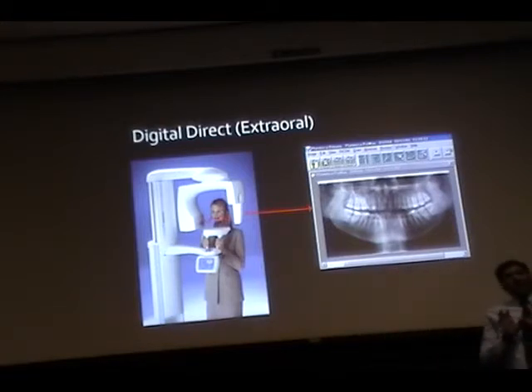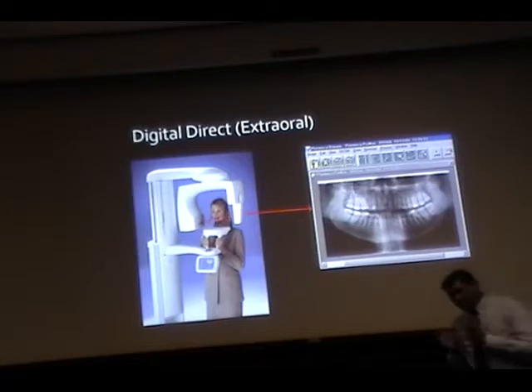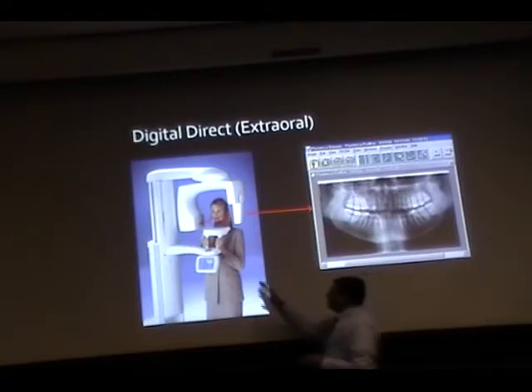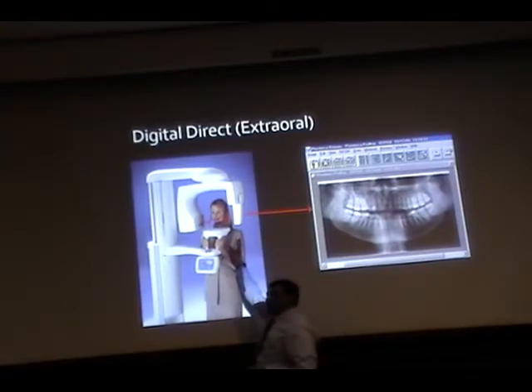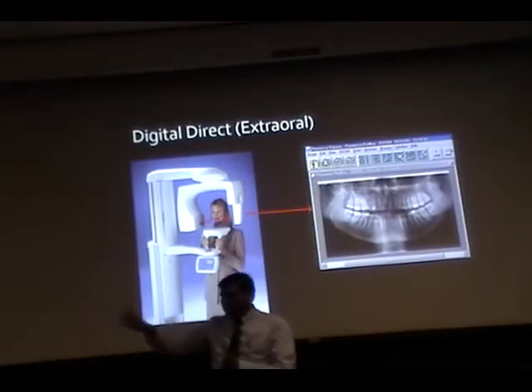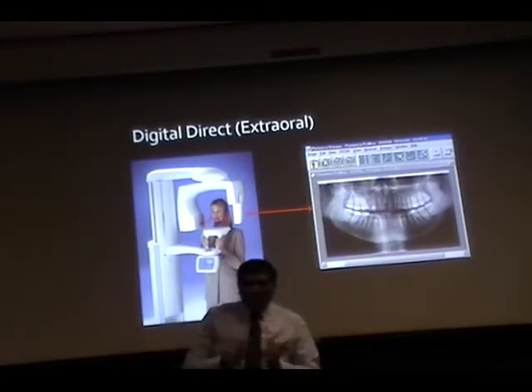When you are planning or intending to buy a CBCT machine, one thing you have to check is whether you want a flat panel sensor or an image intensifier, which we did not really discuss.